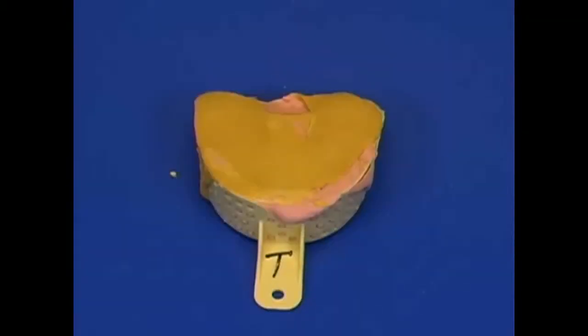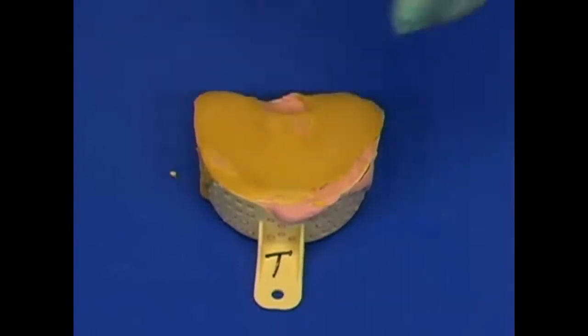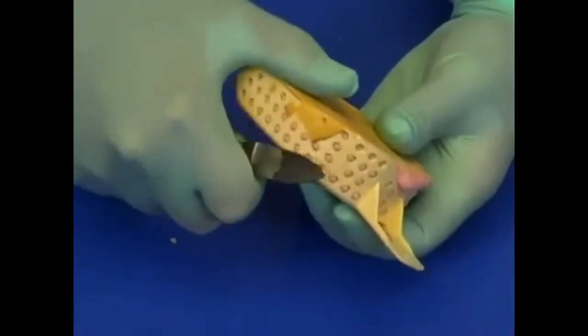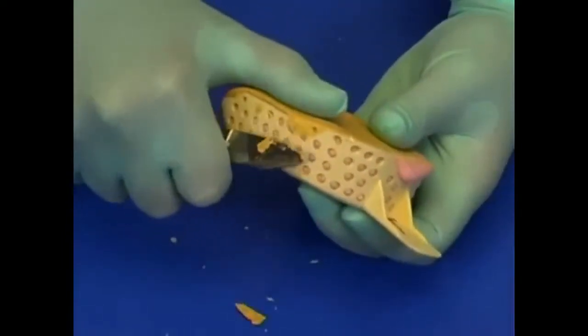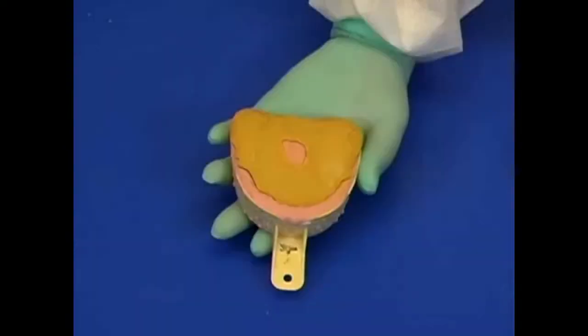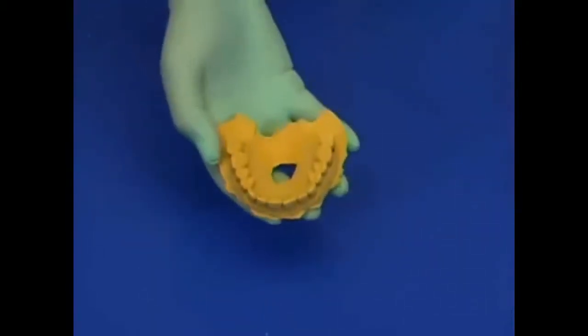Remove the stone model after it is cool to the touch, at least 45 minutes after pouring. Before removing stone from the alginate, take a lab knife and clean excess stone from the tray. Unmold the impression carefully to avoid breakage.